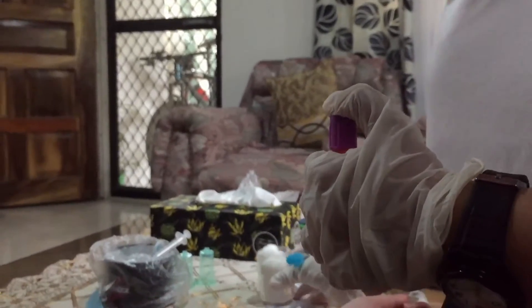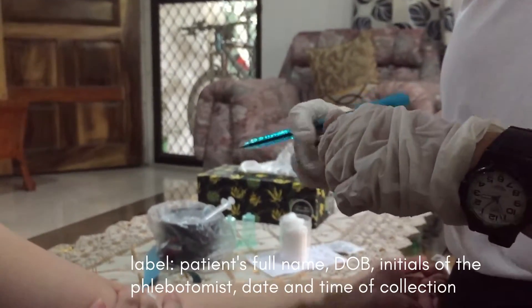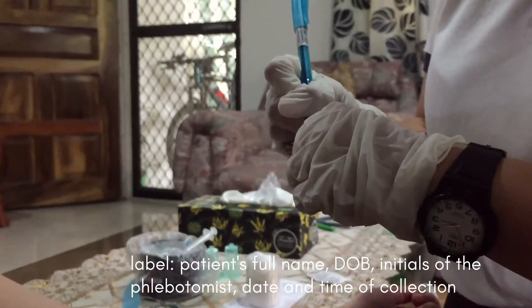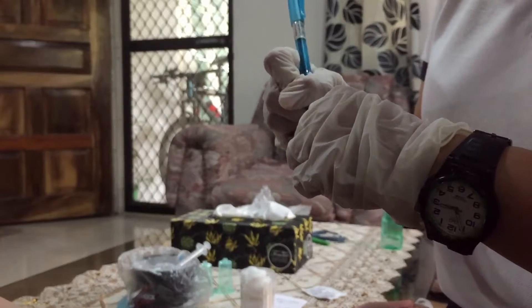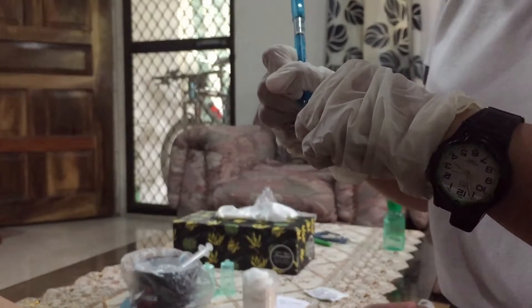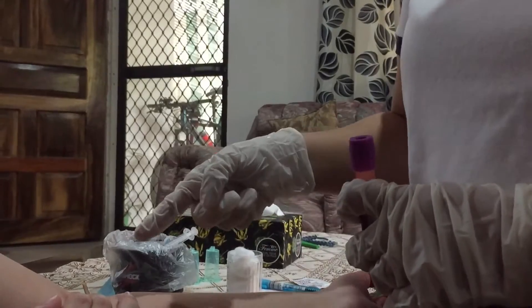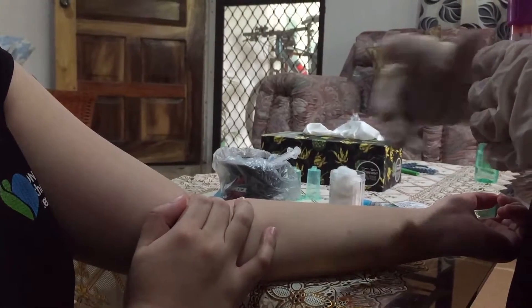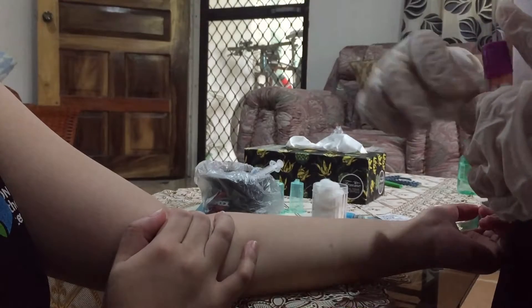Once again, ask your patient for their name and birthday to verify the sample. Label the tube in front of the patient. Ma'am, what is your name? Camille Kate Katailo. And birthday, ma'am? July 11, 1998. Always remember to have the patient press the cotton for at least 2 minutes to stop the blood flow.